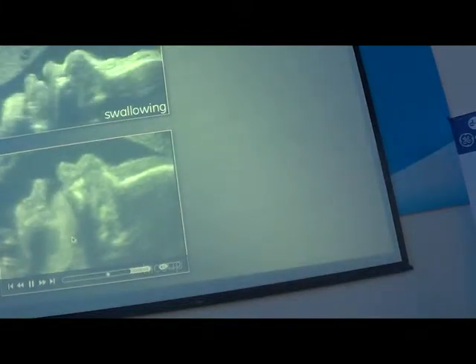We can see the baby swallowing, drinking amniotic fluid. Thai nhi đang uống nước ối. And you will see, especially in the third trimester of the pregnancy. And this one was a baby with a hiccup. Đây là thai nhi bị nấc.